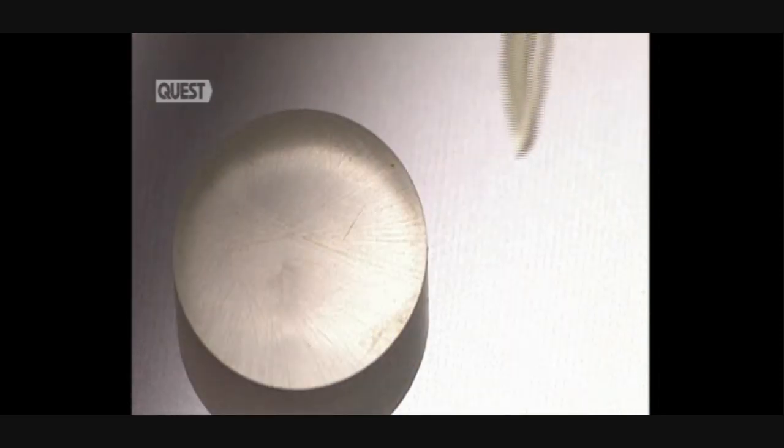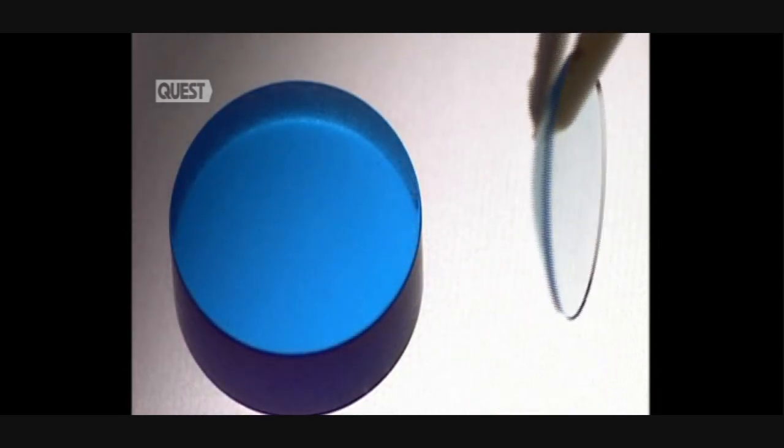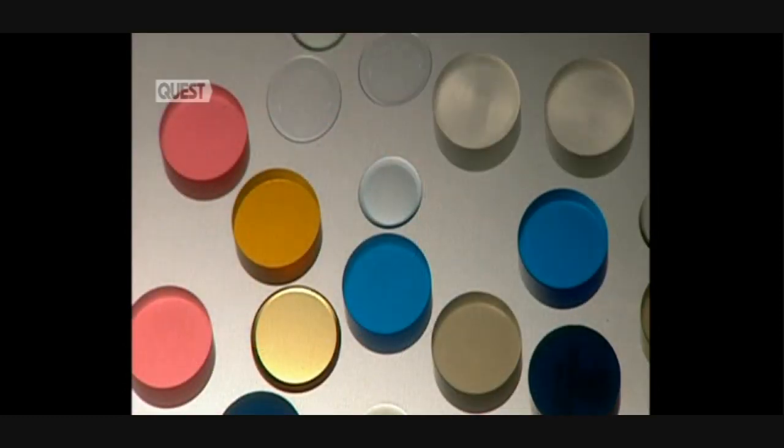Although the production of a lens involves 14 steps, if you exclude the hydration process, it only takes 15 minutes to make one. From these simple coloured discs, a crafted precision piece of technology can transform a person's life.